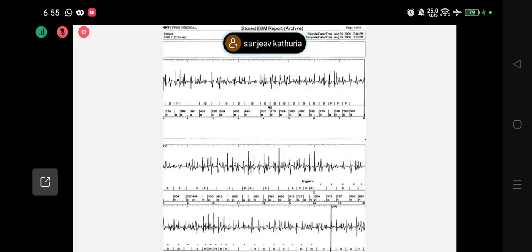So what it will say is, like a judge, if he is able to see the crime occurring in front of him, he does not require lawyers to argue the case. It will straight away say, decided, he has killed, hang till death. So for this machine, if the rate is above a particular range, everything else is shut down. It will straight away fire. This is what has happened.